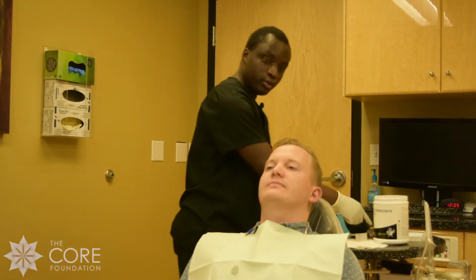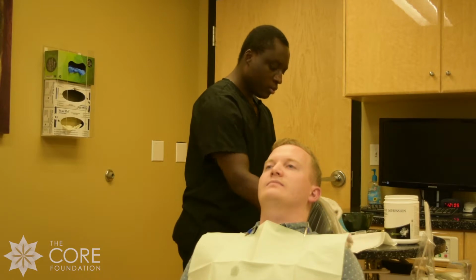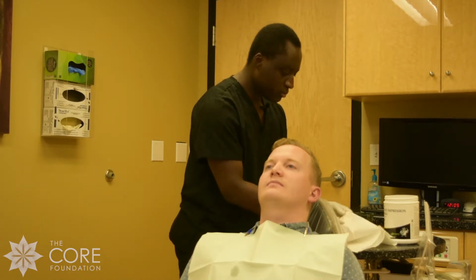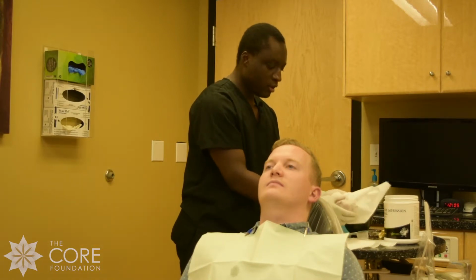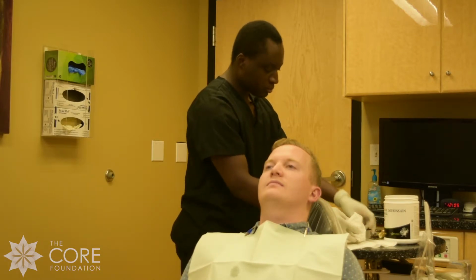Now, because we're going to pour it up, what we'll do next is wrap this in a warm, moist towel. You can use a paper towel for this. Just like that, I wrapped it in a paper towel.